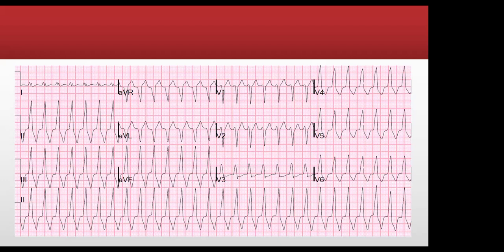Those are the 2 differentials. Sometimes you have to do EP studies to be able to know exactly the underlying rhythm.